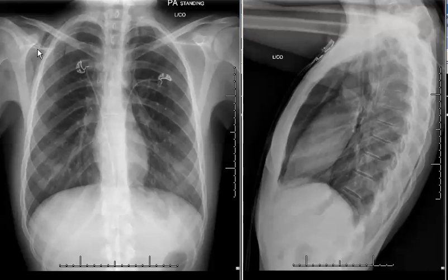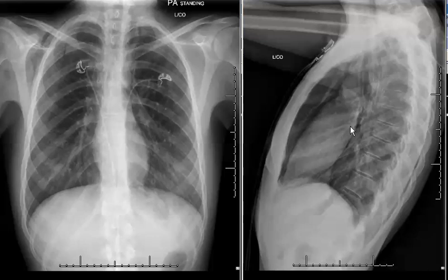In addition, we see some subcutaneous emphysema along the right chest wall here, and also here tracking up into the neck. If we look at the lateral radiograph, we can definitely see air outlining both the anterior and posterior borders of the heart. This extends cranially as well. These findings are consistent with pneumomediastinum.